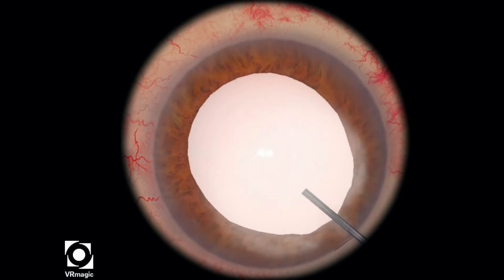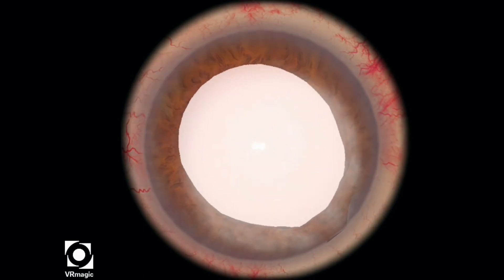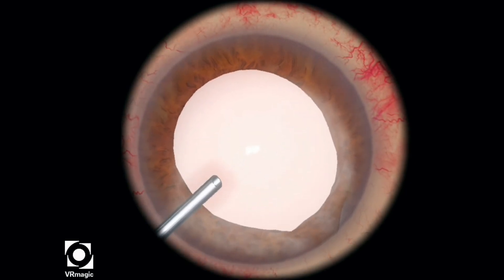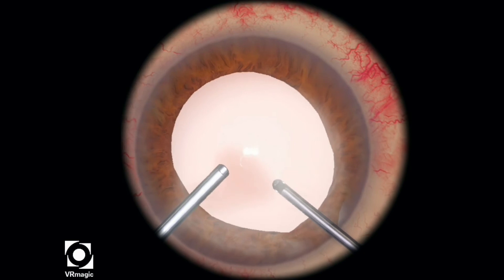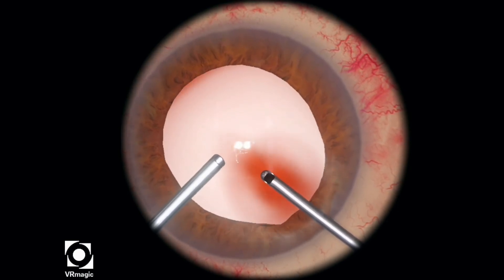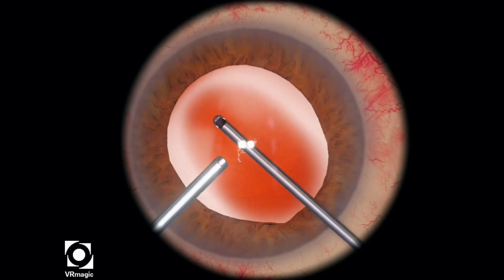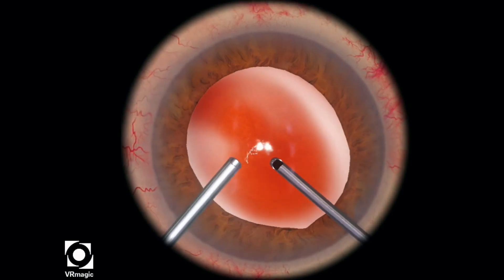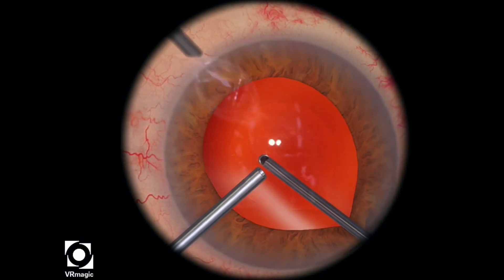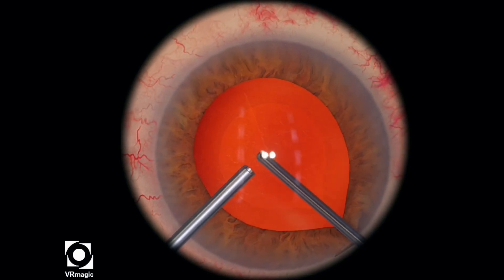When you stain, you see there's a little bit more. One tip I have is that you can point your cannula and poke it through the posterior capsule a little bit where the tear is, and then that might stain the vitreous a little bit easier. So there's a little bit left — I'm going deep behind the posterior capsule rupture and then cleaning up the rest of the vitreous.